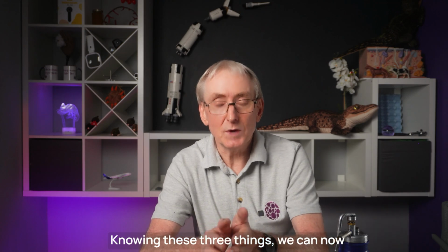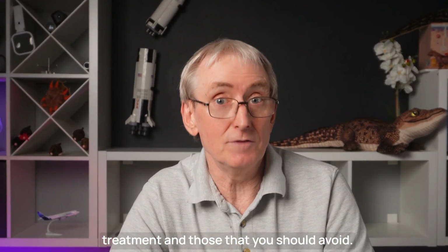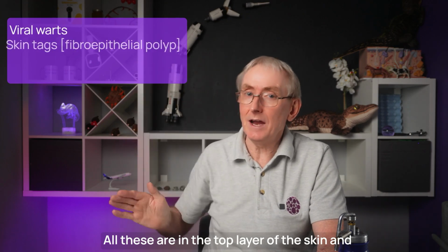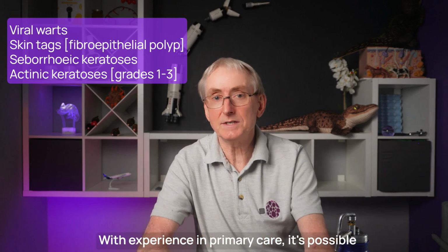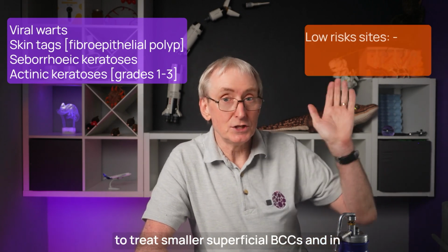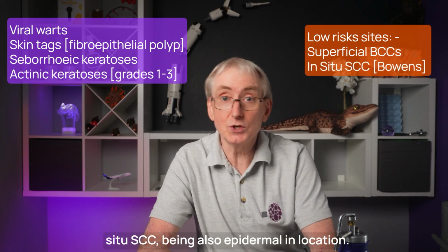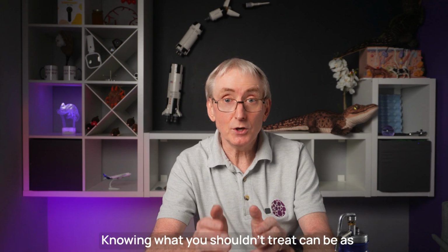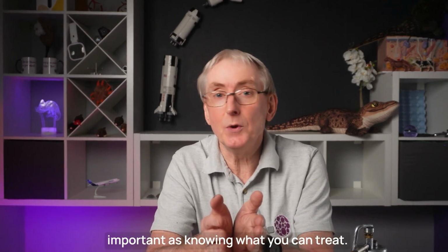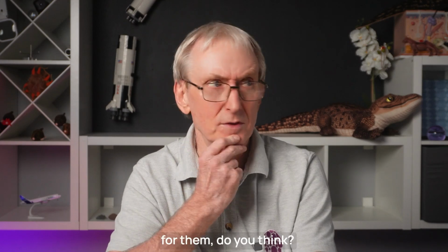Knowing these 3 things, we can now look at the skin lesions ripe for cryogun treatment and those that you should avoid. All these are in the top layer of the skin and are benign, non-cancerous skin lesions. With experience in primary care, it's possible to treat smaller superficial BCCs and in situ SCC, being also epidermal in location. Start with the simple stuff first. Knowing what you shouldn't treat can be as important as knowing what you can treat. Undiagnosed skin lesions. Can I repeat that too often for them, do you think?